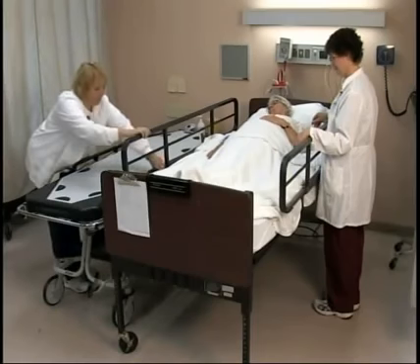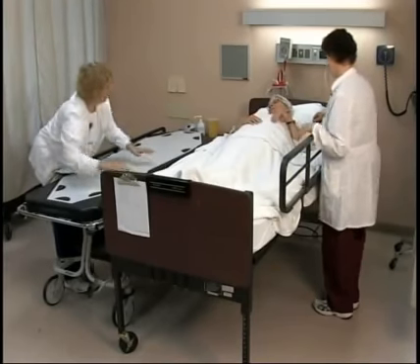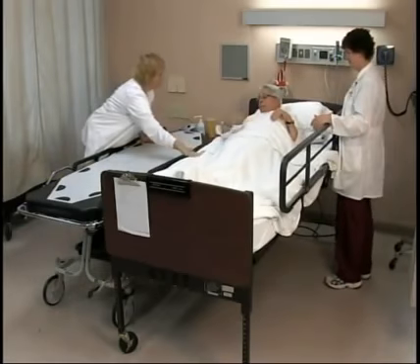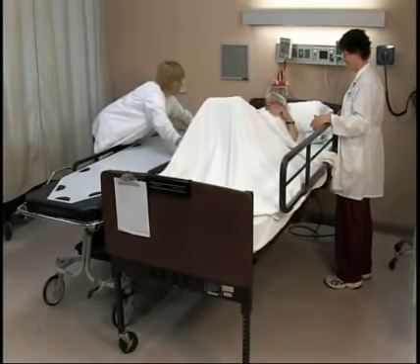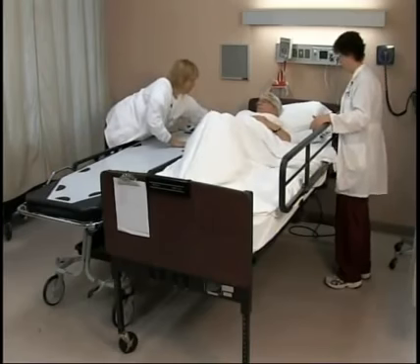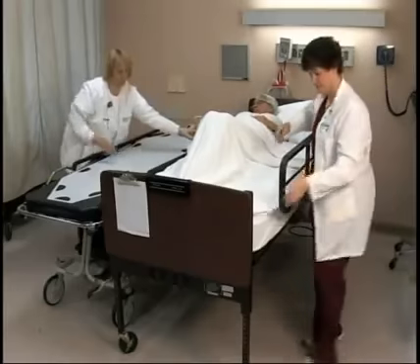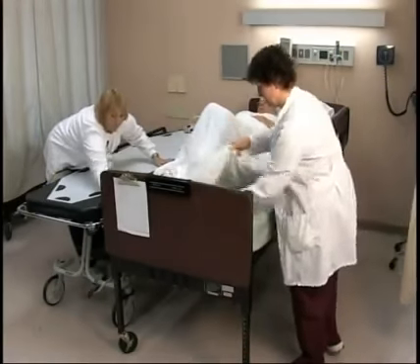With the stretcher in place, put the side rail down on the side that you will be working on. If the patient is able, instruct them to move their hips and body toward the edge of the bed as you guide them. If they cannot, utilize the pad to pull their hips toward the edge of the bed.